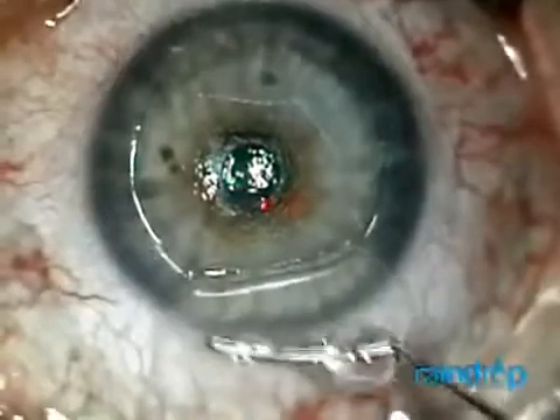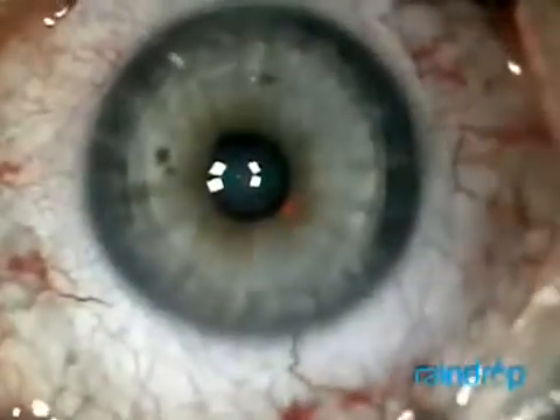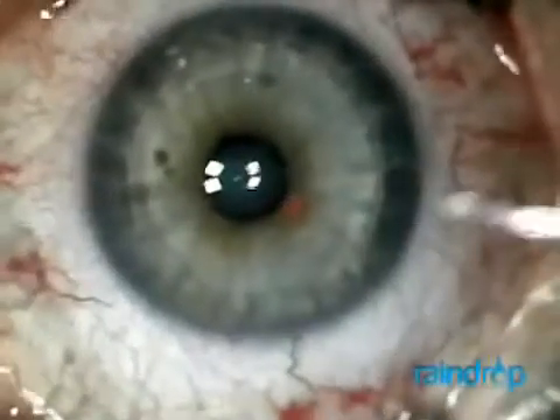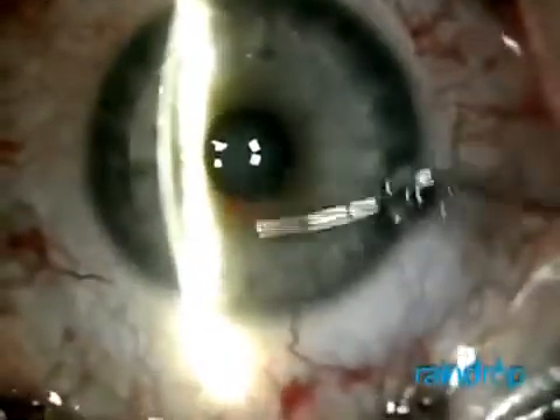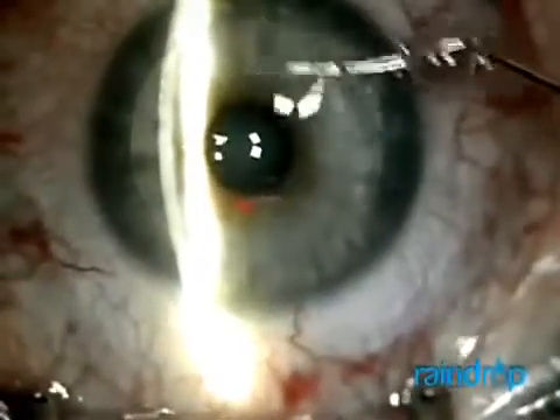You can see the raindrop dimpling. Then in one smooth motion, I lay the flap back over the stromal bed and inlay. I check to make sure the flap is appropriately positioned.